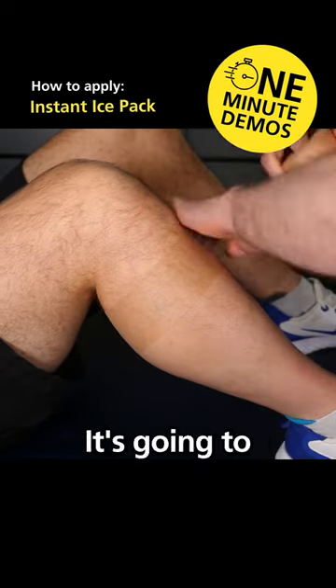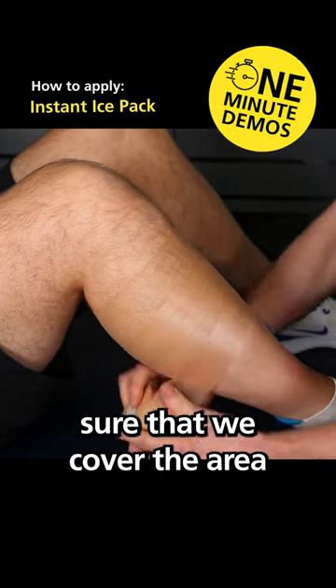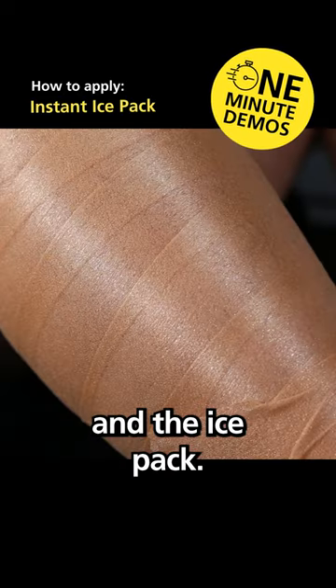We're just going to apply this underwrap. It's going to create a little bit of compression for us as well, just to make sure that we cover the area that we're working on. This is to reduce the risk of ice burn and create a barrier between the skin and the ice pack.